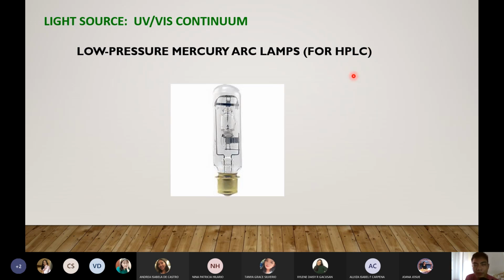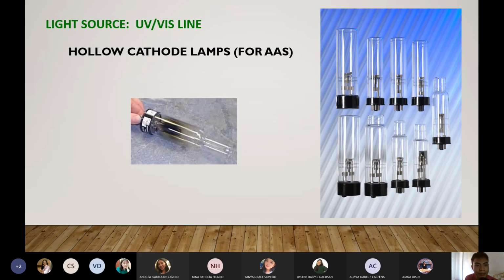Okay. Pwede rin gumamit ng GCMS, no? The gas chrome mass spectra. So basta yun yung mga ginagamit in quantifying mga molecules in our samples. For example, blood, no? Okay.